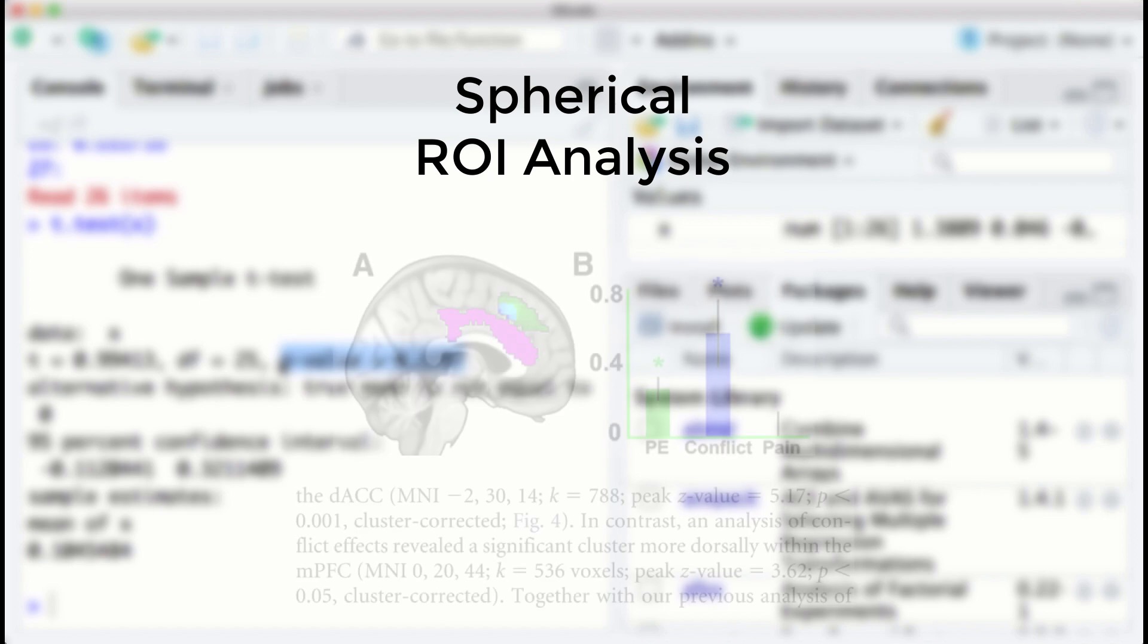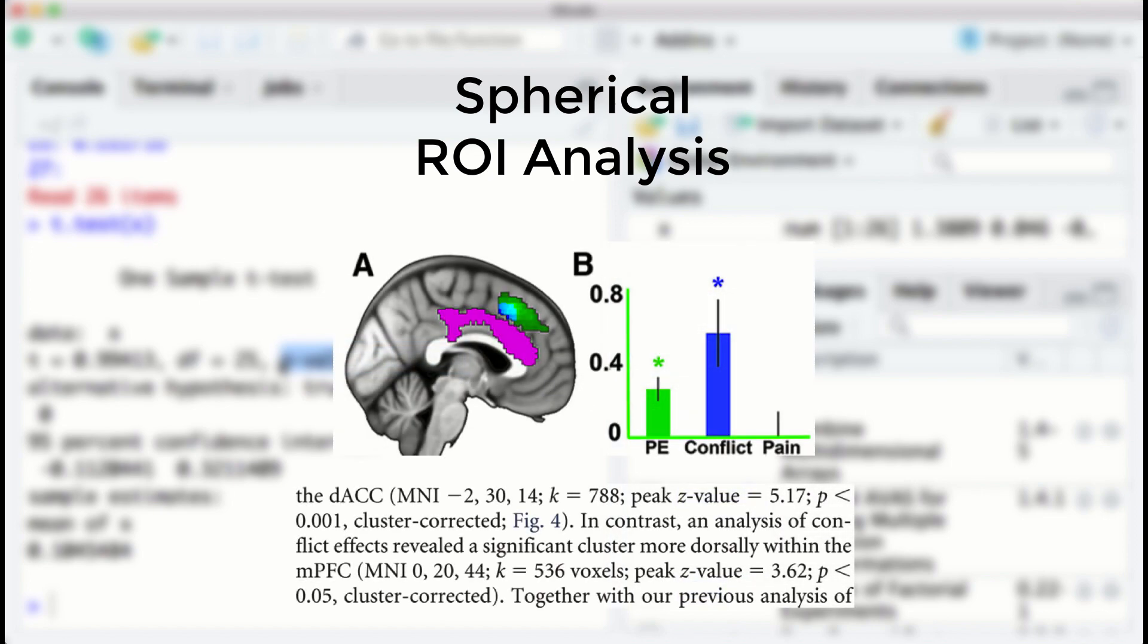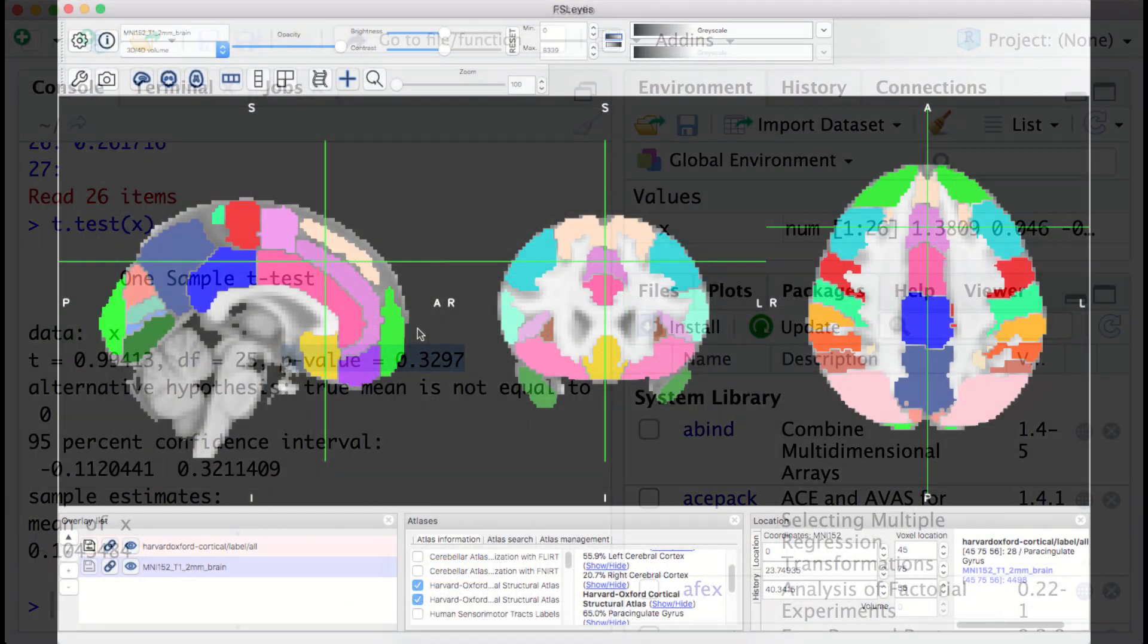For example, let's say that we read a paper examining cognitive control effects and that they reported a peak activation at the MNI coordinates 0, 22, 40. Now, the procedure in FSL for creating a sphere from these coordinates is a little weird, but stay with me.